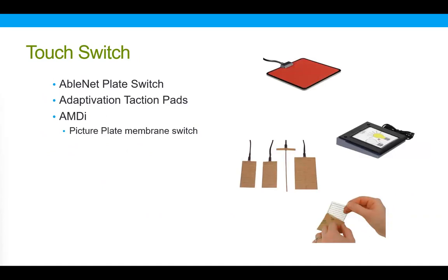So these switches, if they're a true touch switch, will not work if I'm wearing gloves, for example, but they will work with bare skin or another conductive surface, similar again to our phone or to a tablet. So we've reduced activation force to just about nothing on these touch switches. The client does still have to reach out.